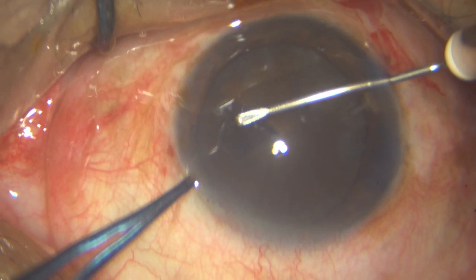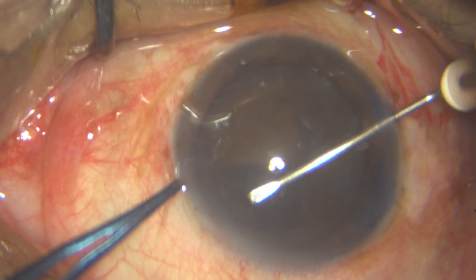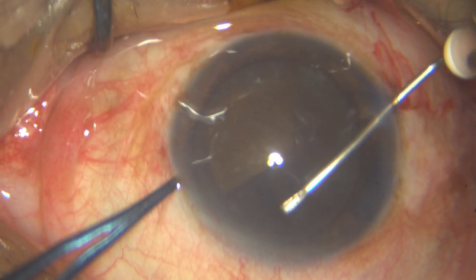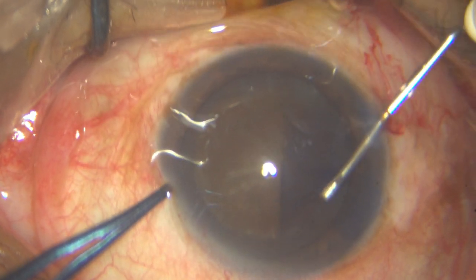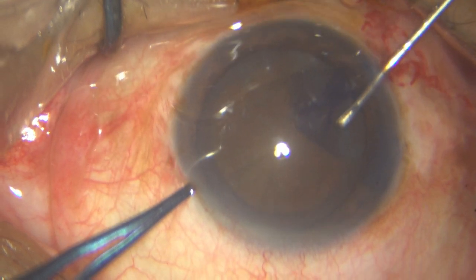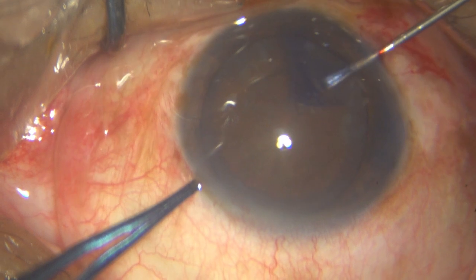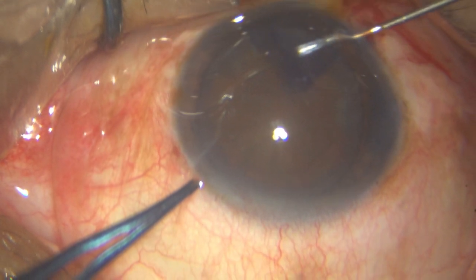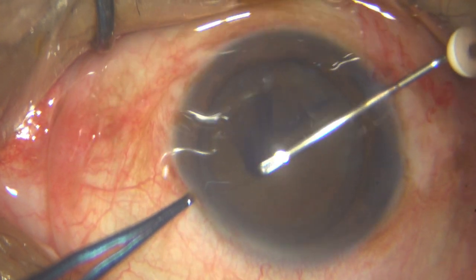So here with my cystitome itself, I am targeting the largest rhexis. Definitely more than 5.5. It's not the recommended 5.5 size. It is larger than that. And the problem here is I have got more issues than actually thinking about centration of the IOL, etc.